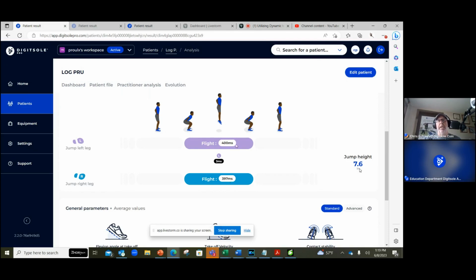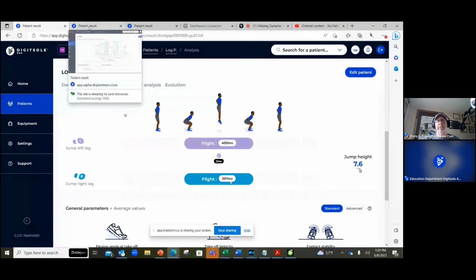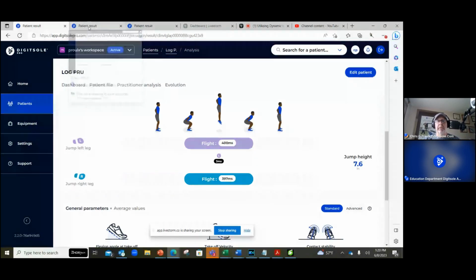Now, because we have sensors in the foot and not just using a force platform, we're actually getting a lot of the similar characteristics that we're able to capture in some of these others. Now, I'm going to take a quick moment here because what I personally do, if I'm not working with large groups, I like to take either a run or a walk. I at least always take a walk. And so let me show you real quickly a couple of things here.